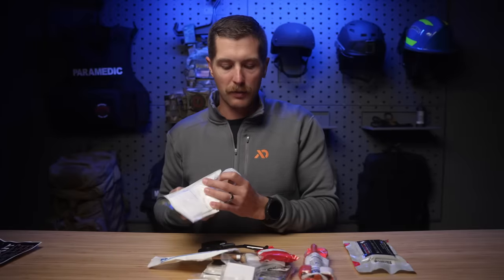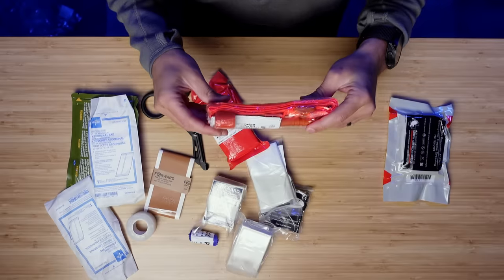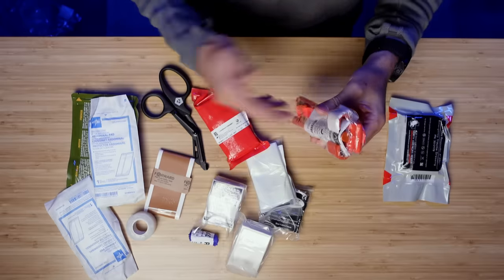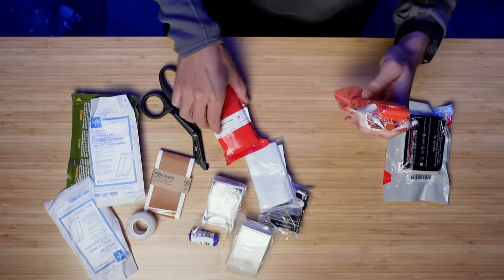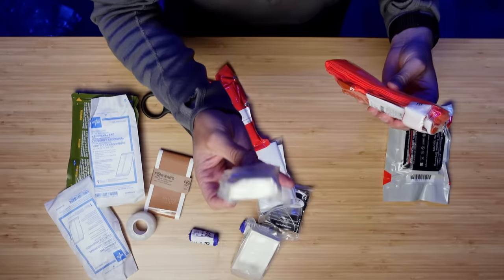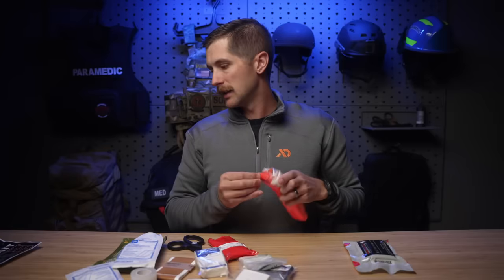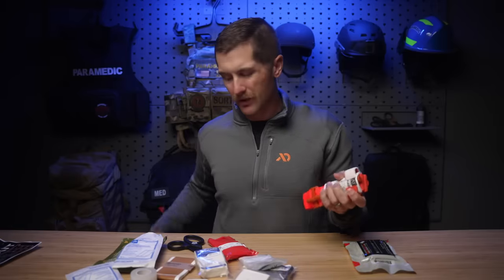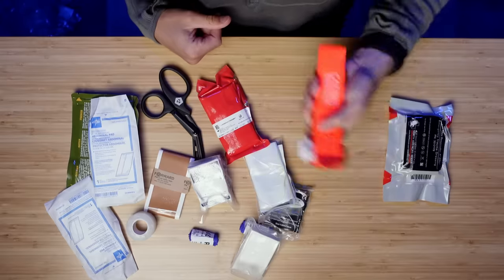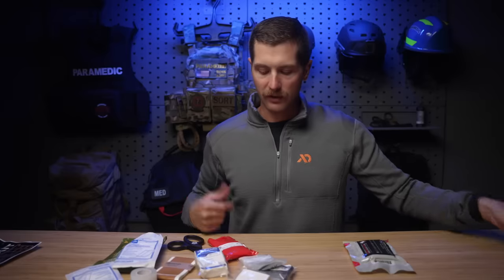So let's start going through this piece by piece, starting with the big ticket, major life-saving items. We have a CAT tourniquet. I would like this to be packaged without the packaging on — I get why they do this, there's probably liability to taking it out of the case before they ship it, but this is just one more wrapper you're going to have to get into. If you are going to take everything out of the kit, I would recommend just taking off the plastic first. It's not a huge deal, but it's going to make access a little bit easier. I like that it's orange — that makes a lot of sense for the civilian environment. We don't really need black blending tourniquets most of the time.